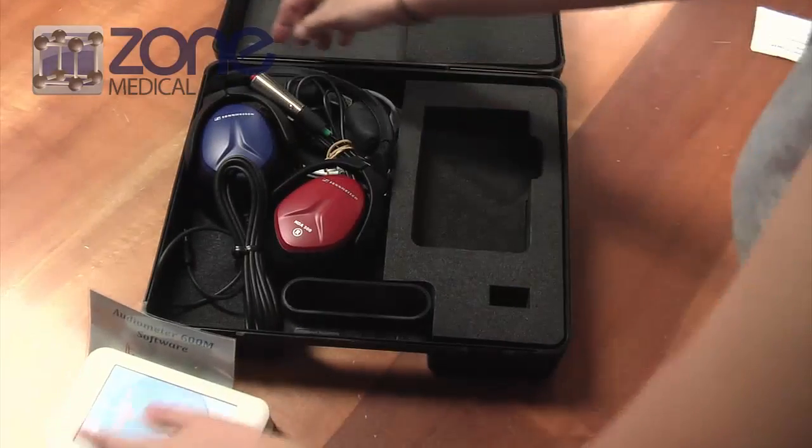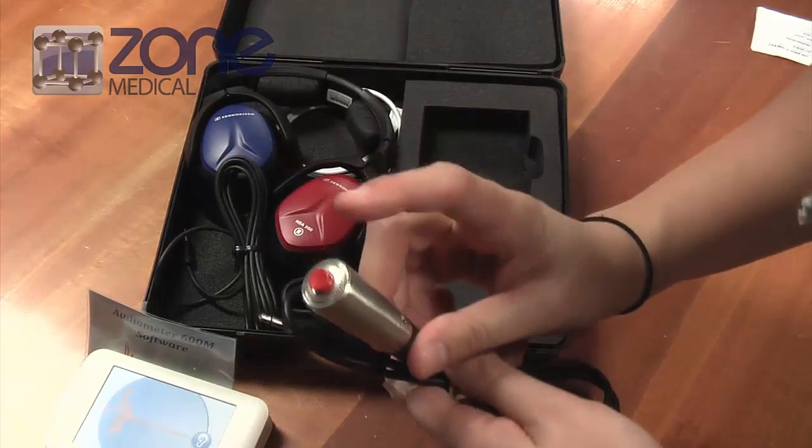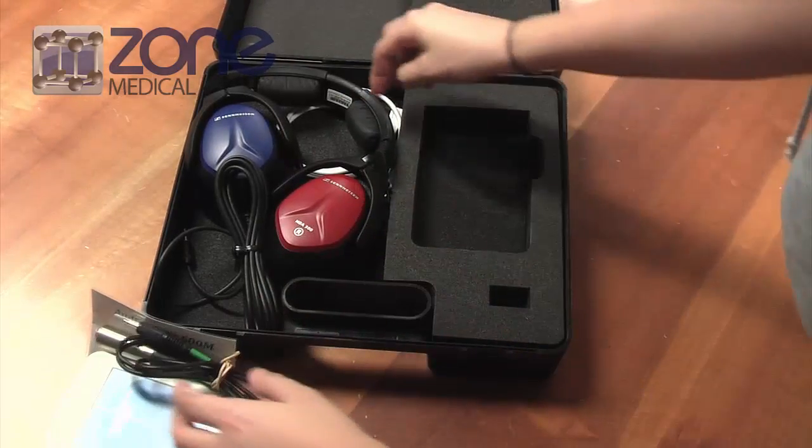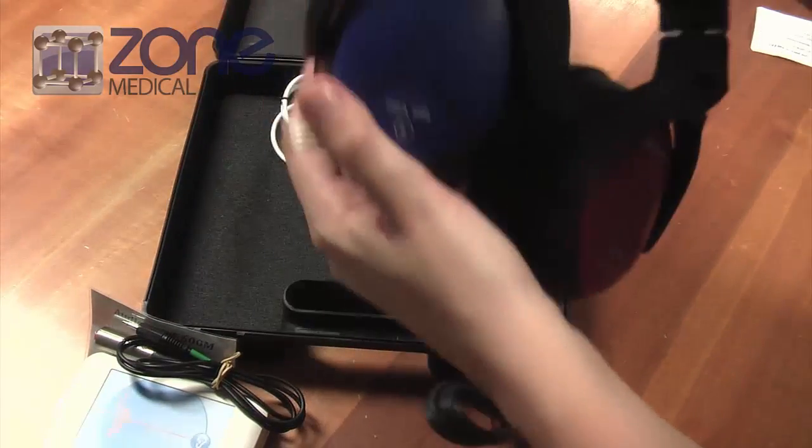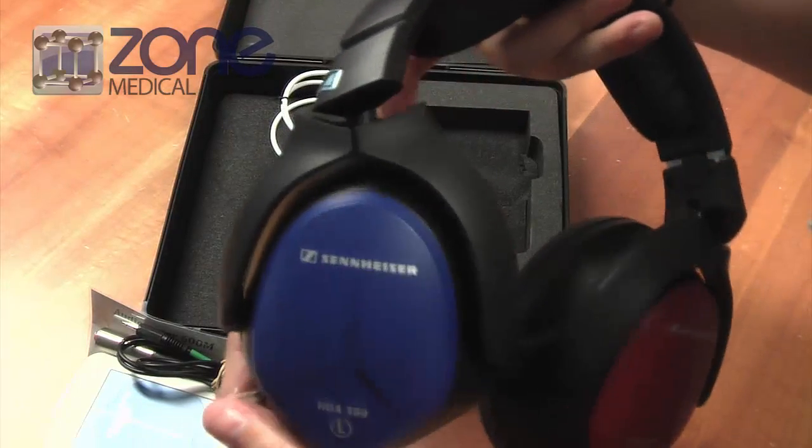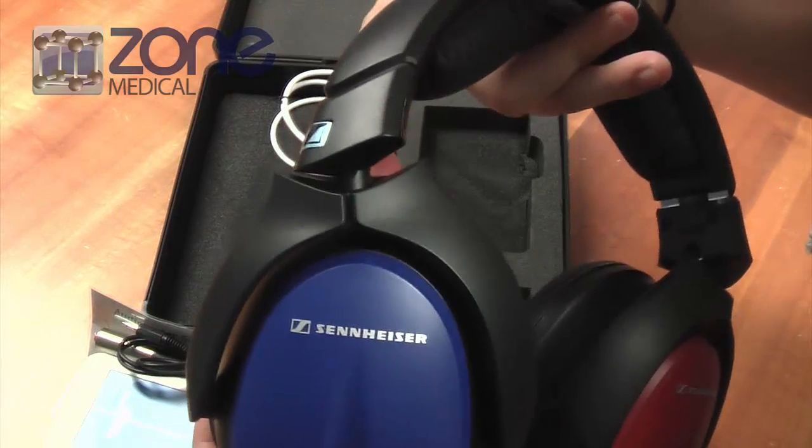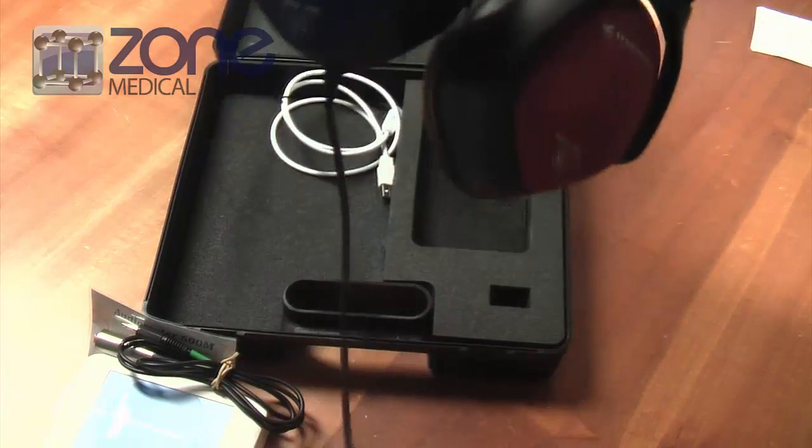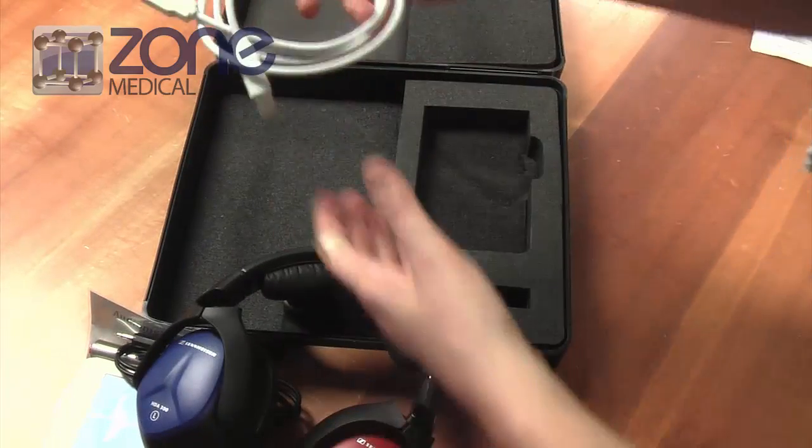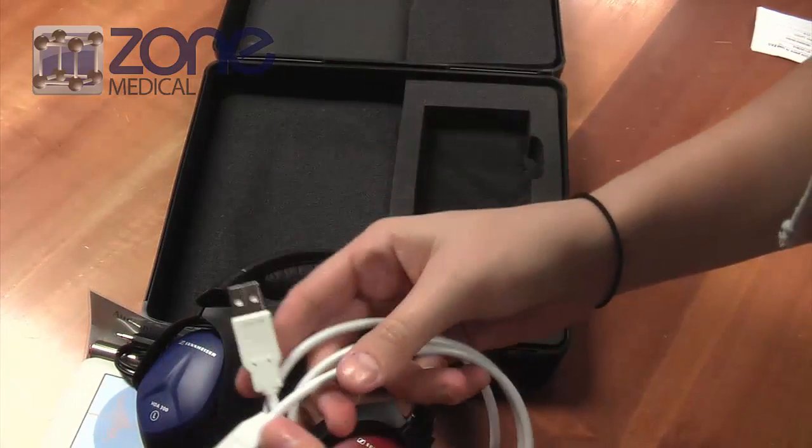You'll also find the response switch for the patient to use, the new and improved Sennheiser headphones which are top of the range for audiometers, and the USB cable.